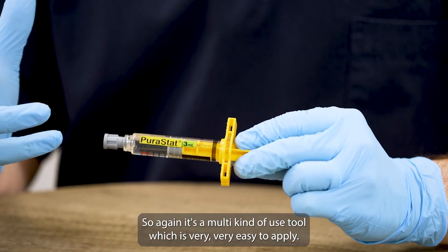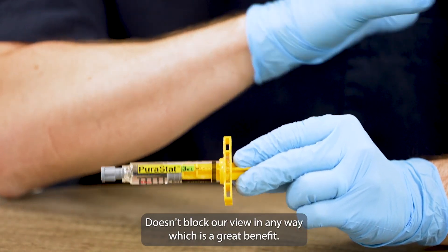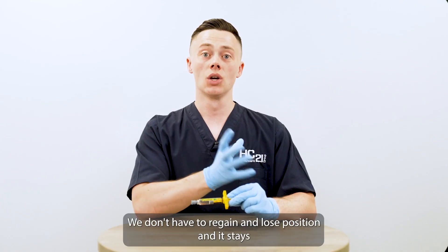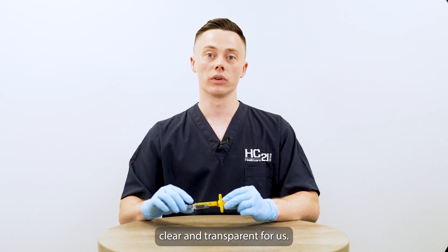It's a multi-use tool which is very, very easy to apply. It doesn't block our view in any way, which is a great benefit. We don't have to regain and lose position, and it stays clear and transparent for us.